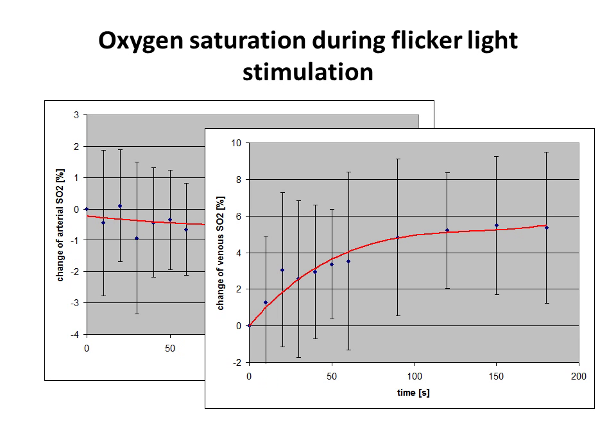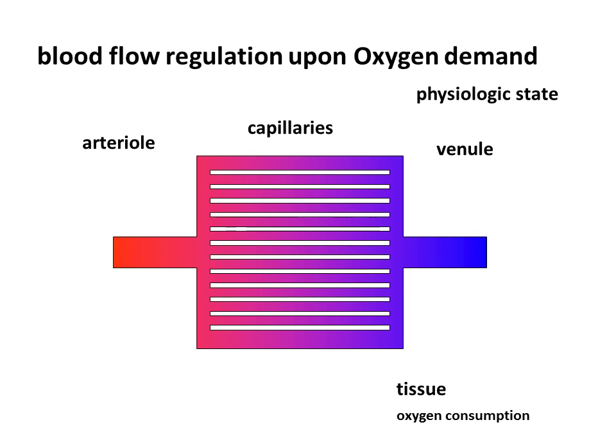We get an increase of the oxygen saturation in the veins by about 5% during the flicker. The response is not that fast. For the saturation response we need about 90 seconds to reach steady state, versus about 20 seconds for the diameter, but basically we get this increase. And now, what is our idea about the mechanisms?